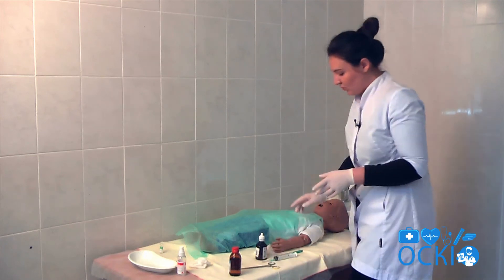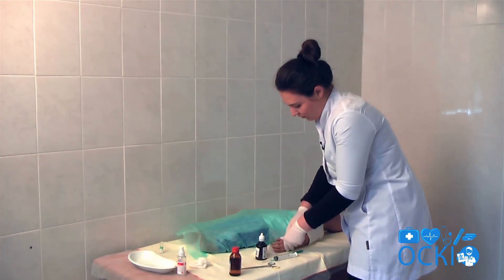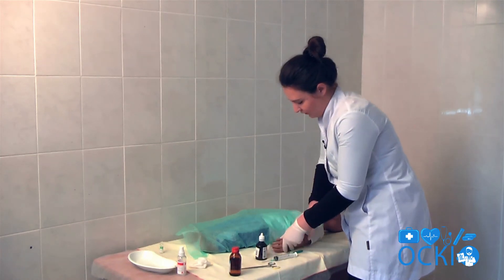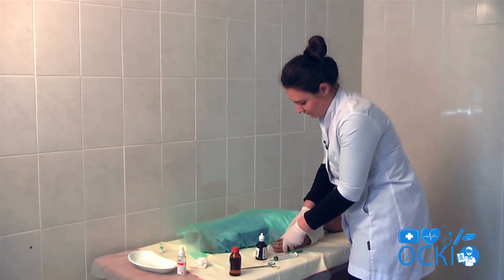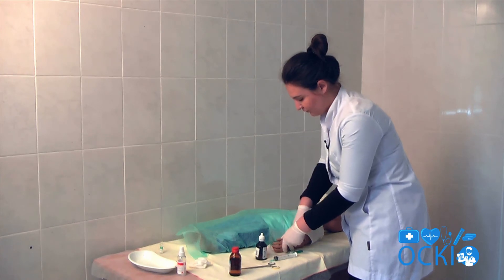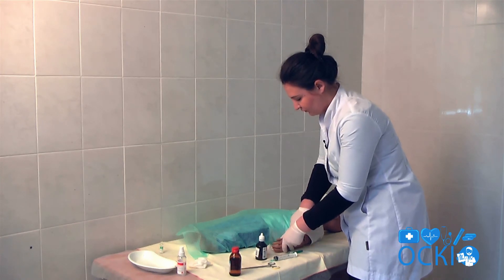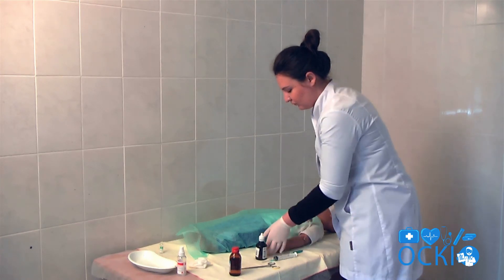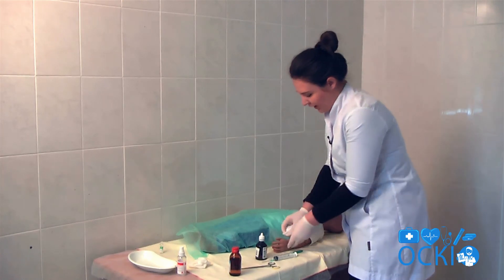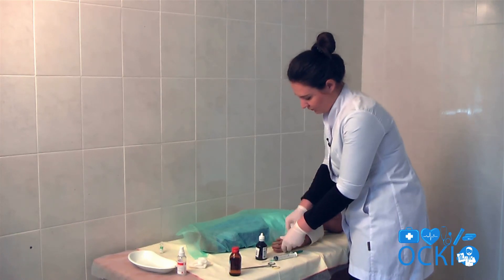After that, destroy with your finger all pockets of the cavity. Clean the cavity from necrotic tissue.